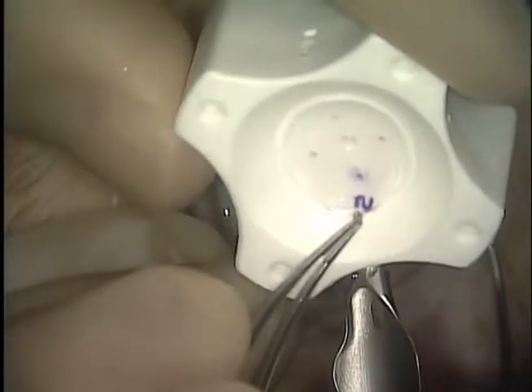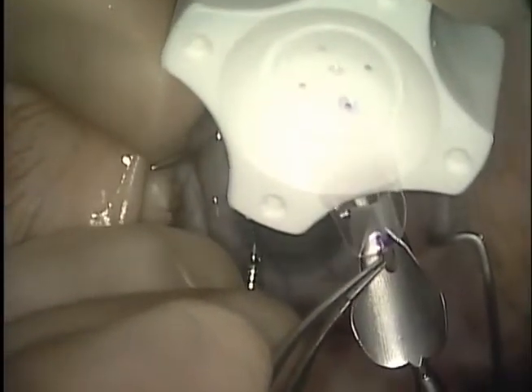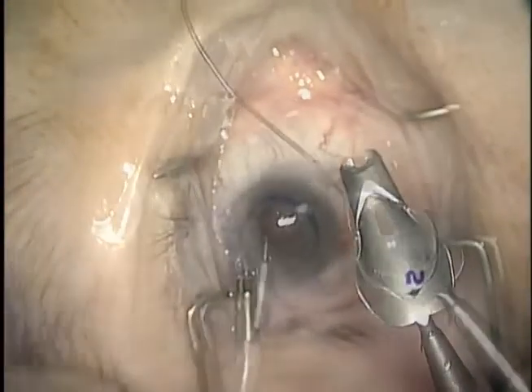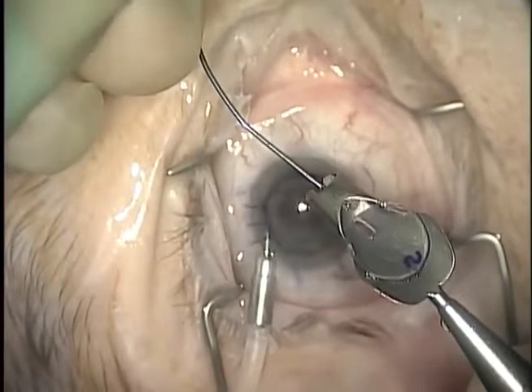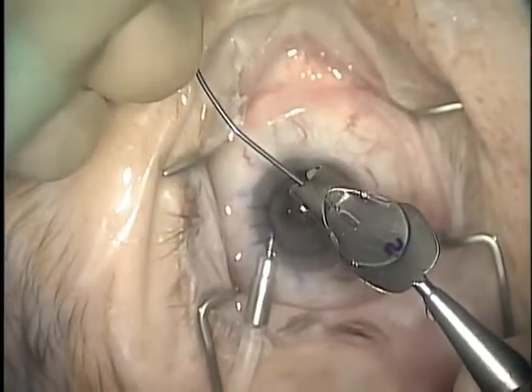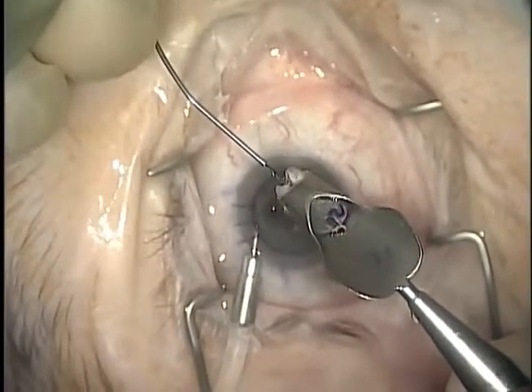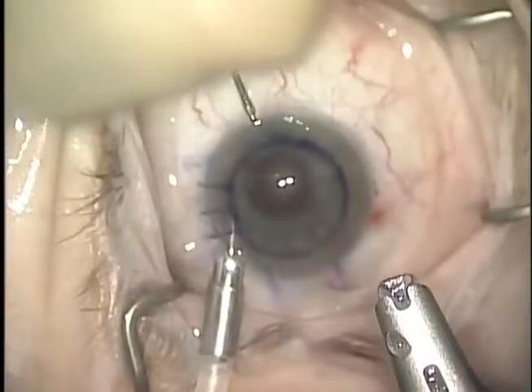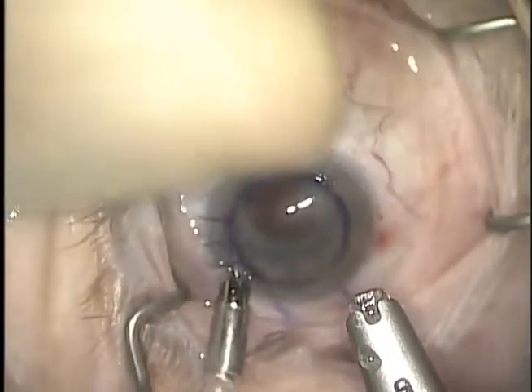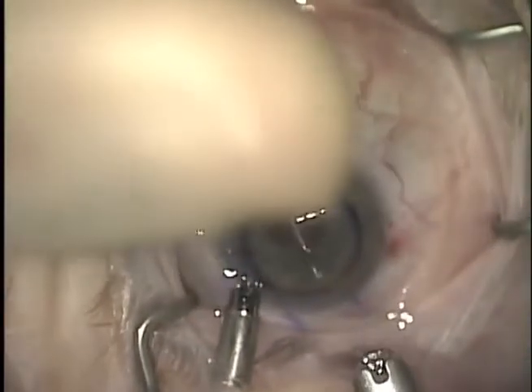Next, the graft is transferred to a Busin glide and brought into position using a 25-gauge Grieshaber ILM forceps. The ILM forceps are used to finish positioning the graft in the Busin glide. To place the graft, the ILM forceps are inserted through the superior nasal stab incision and out the temporal wound to grasp the donor graft.